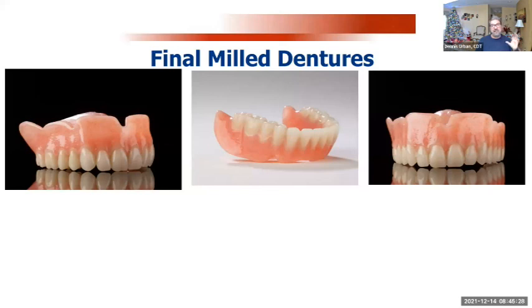With any of these software systems, you can actually utilize other pucks also. This happens to be Diamond D. I talk about Diamond D a lot. This is a different type of denture base material, with high flexural strength and high impact resistance. I utilize this material a lot for implant cases also. But I like to show this as my first ever digital denture, and I was proud of it because it worked out great. And it didn't take me long to learn how to utilize the design.